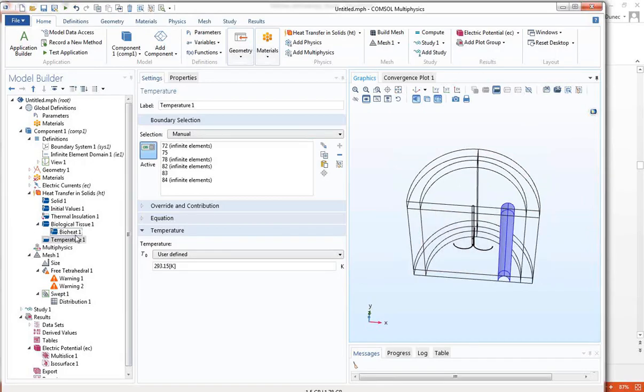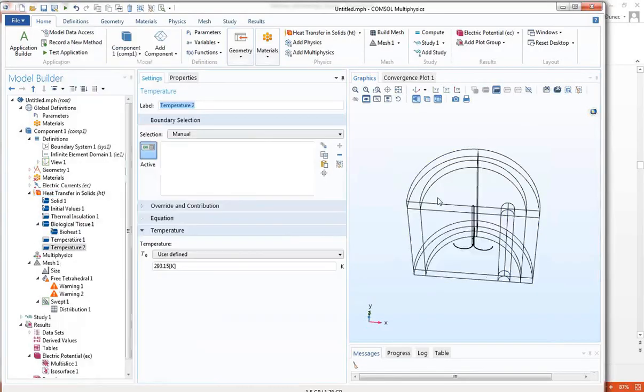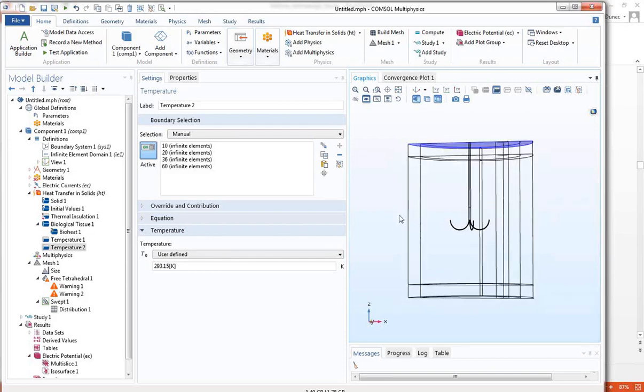Okay. And then I'm also going to right-click. I'm going to do a temperature boundary condition. Okay, and then that is going to be on all of the top boundaries. So I'm going to drive it down to T blood, and then drive it down to T blood at the bottom. Well, hold on here. I better orient it a little bit better. There we go. And we'll do the same thing down here.